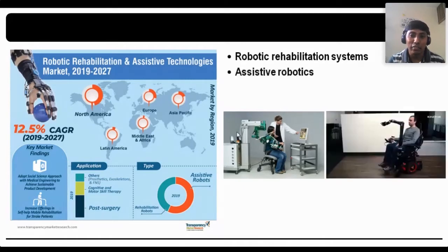The second thing is assistive robots, which can be any kind of assistive device. I put one figure where a lower-limb impaired person needs a wheelchair, but when sitting in it he needs to mobilize himself and also manipulate objects. He cannot manipulate all the time because one arm might be paralyzed. So he can use one arm for operating and use another, a mechanized arm, to assist him. This is one kind of assistive robot.